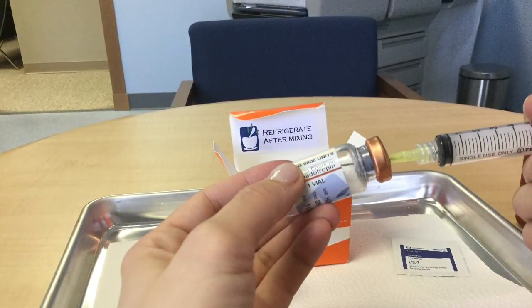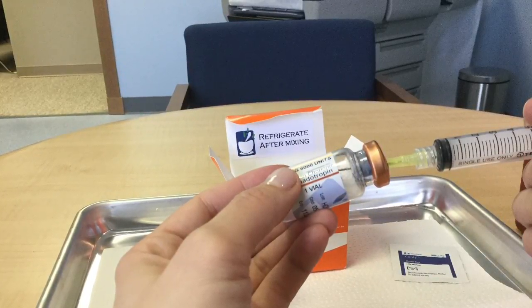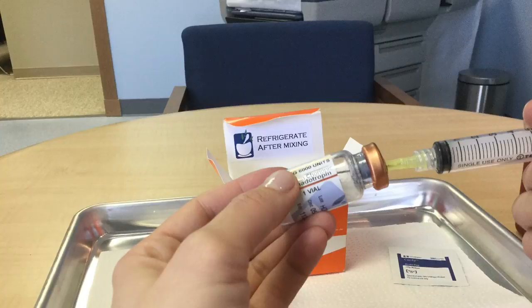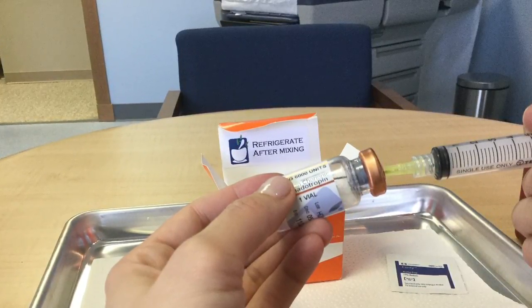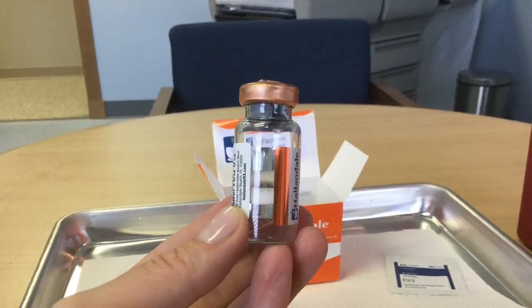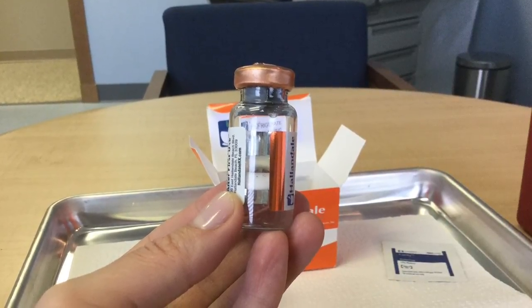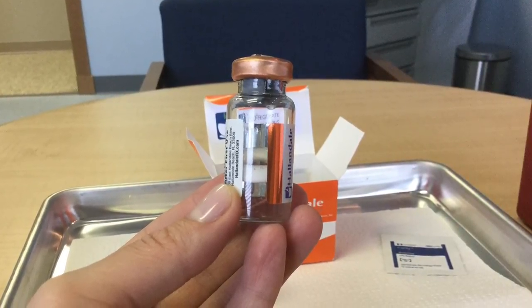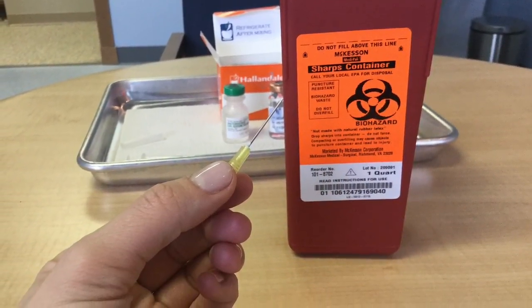Next, I'll take that bacteriostatic sodium chloride that I drew up in my syringe and go ahead and puncture the top of the HCG vial. Usually, due to the back pressure, the vial just sort of sucks it out of the syringe. Go ahead and invert the vial once, and then you'll see the solution is mixed and it's a little bit foamy. I'll go ahead and twist the needle off of the syringe and place it in my sharps container.